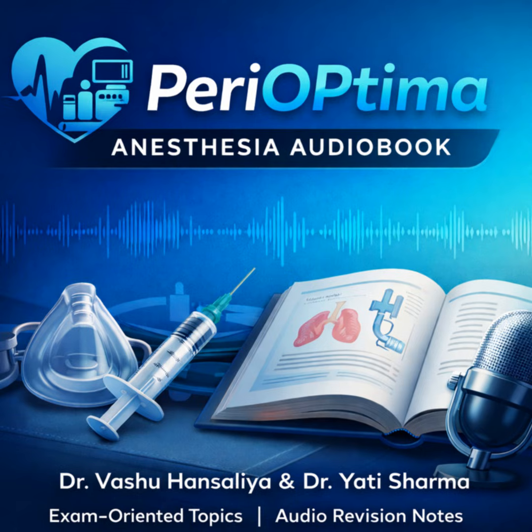Exactly. To make the tube follow the curve of the blade and pass smoothly through the glottis, you must use a pre-shaped stylet. A hockey stick shape. The classic hockey stick shape. You bend the stylet to match the curve of the blade. Forgetting to use this stylet, or not shaping it correctly, is the number one reason people struggle with VL, even when they have a perfect grade 1 view on the screen.